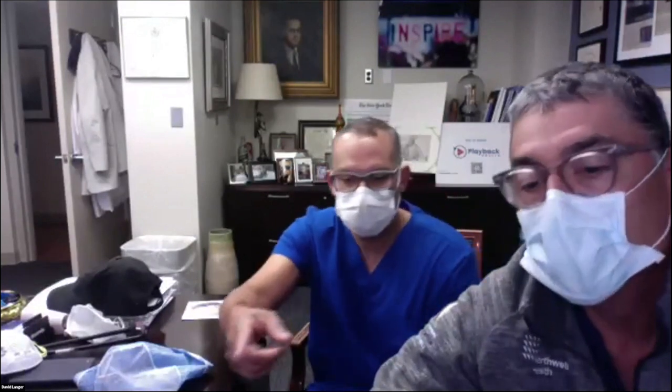It was a challenging case to be able to coil by endovascular means, mainly because of the shape of the aneurysm. We could not see the entire aneurysm in just one projection. So we had to use a lateral view to look at the origin or the neck of the aneurysm. And then we had to use the other view, the AP view, so that we could look at the distal end of the aneurysm. I'll share my screen.